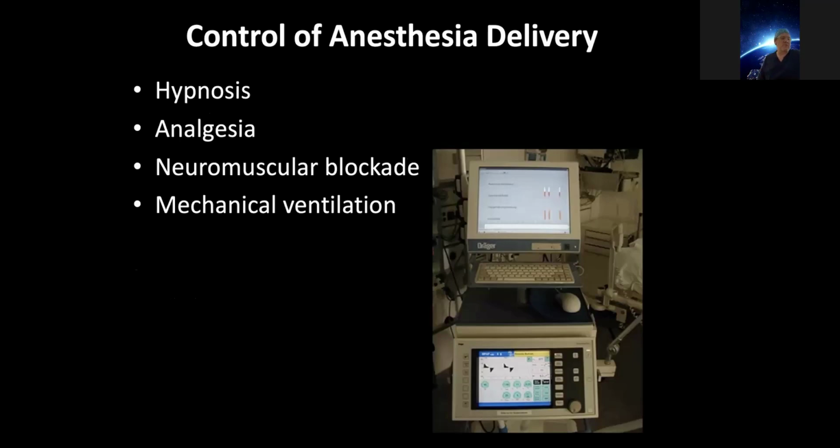As some of you know, we have many years ago designed a sort of anesthesia robot called McSleepy, and it had 3 parts of the anesthesia delivery, all the 3 parts which we actually use: hypnosis, analgesia, and muscle relaxation, controlled using these algorithms and using artificial intelligence, and it actually worked very, very well.